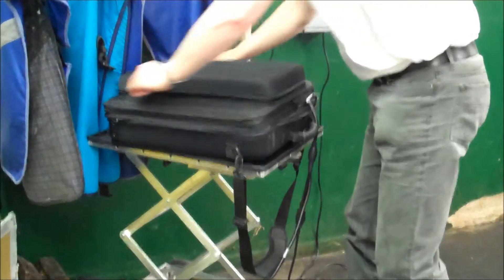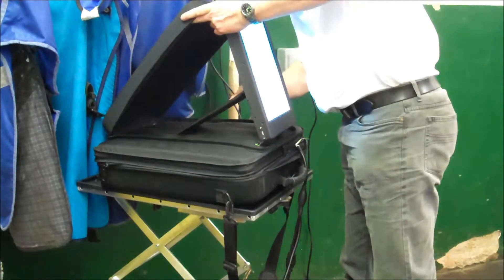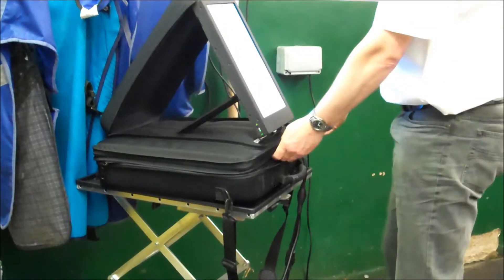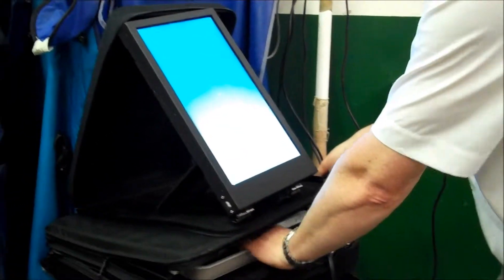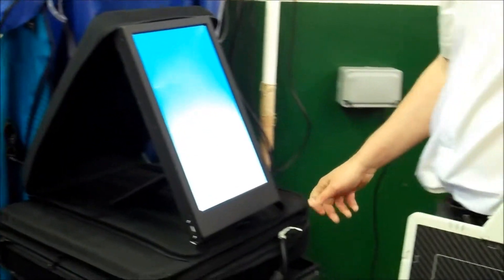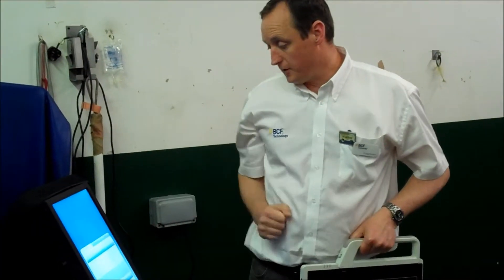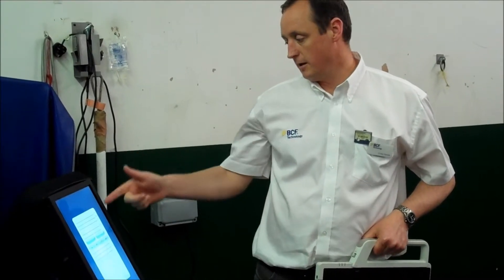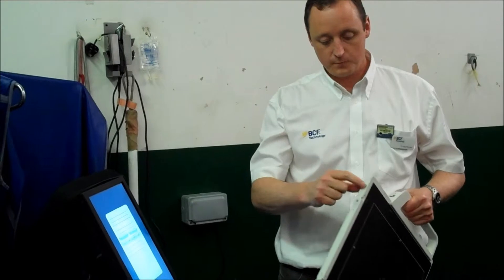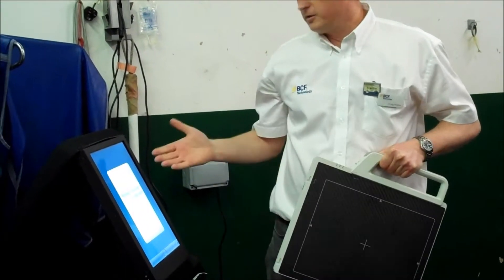At this stage, open up the panel, take out my plate, and the system is ready to boot up. So at this stage, I can now add a patient, populate the patient name, turn the machine and boot the plate on. And I'm ready to proceed with taking x-rays.